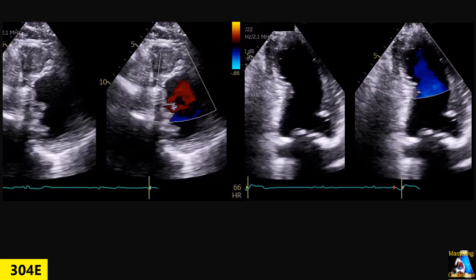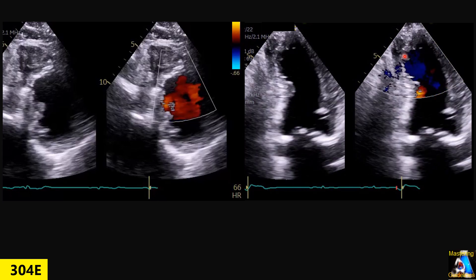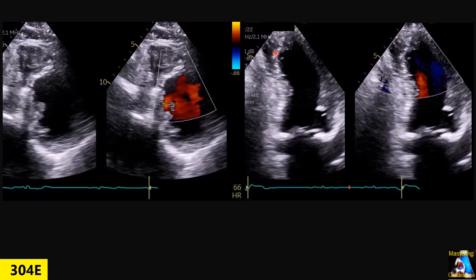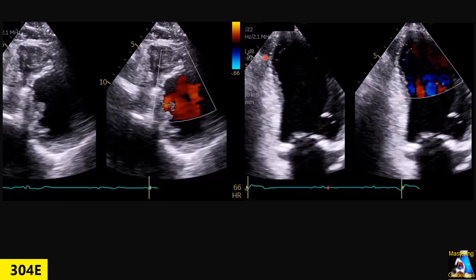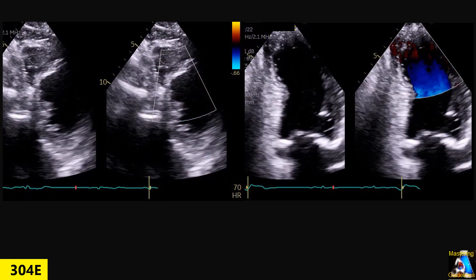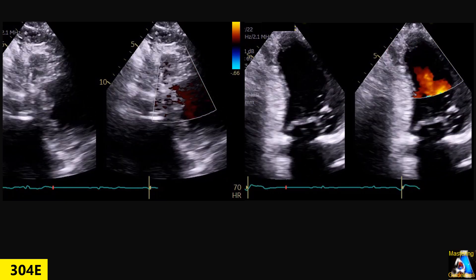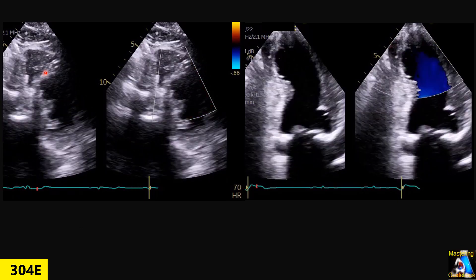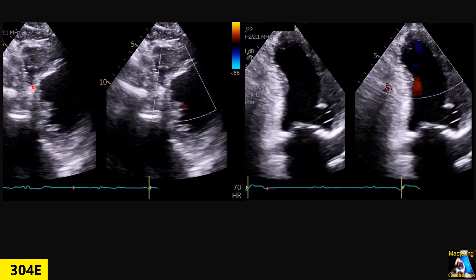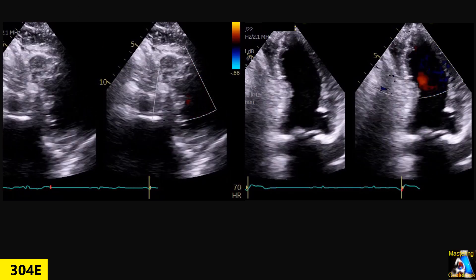Here are those extra views where you can see things much better. We have dyskinesia at this level — bulging during systole — especially obvious on this view. In the short axis, it is very obvious: we can see thinning at this level, not just thinning but also a little bulging out during systole. So all of these views confirm this patient had CAD, not cardiomyopathy.